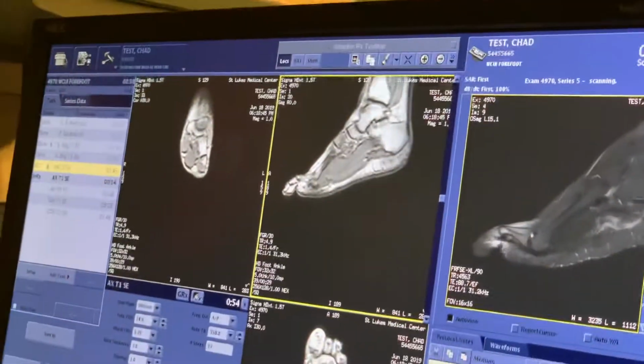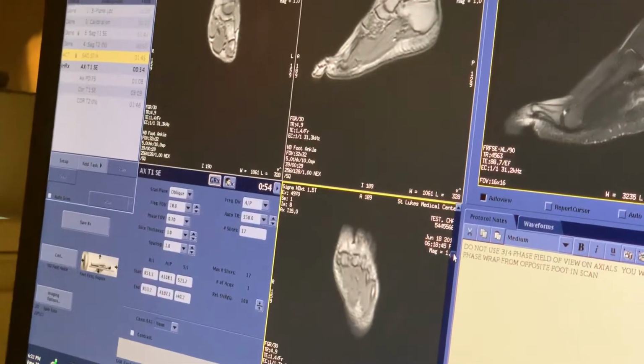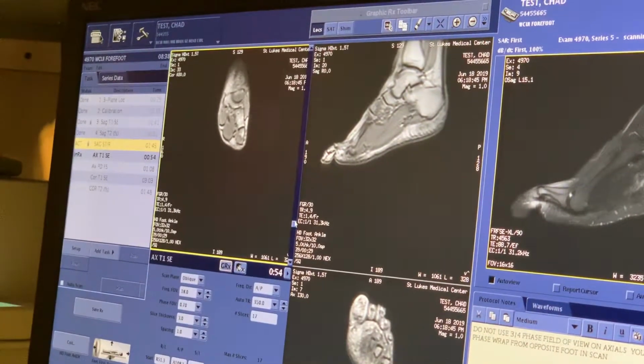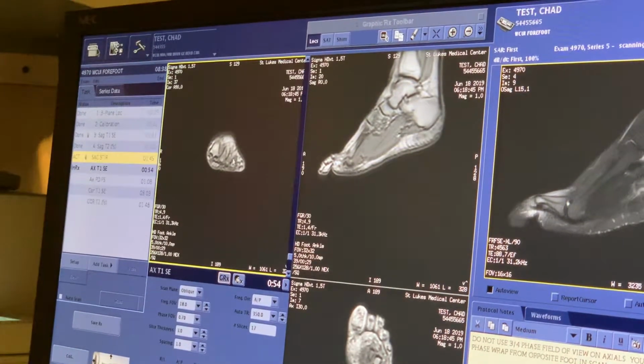So let's go ahead and make sure I get, again, I'm going to do my setup. Because this foot is sort of on an angle in here, I can't really do a very good job of that. I want to find a nice mid-metatarsal right there, like that.